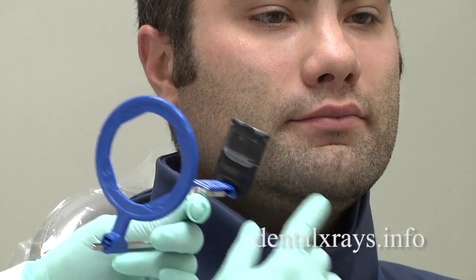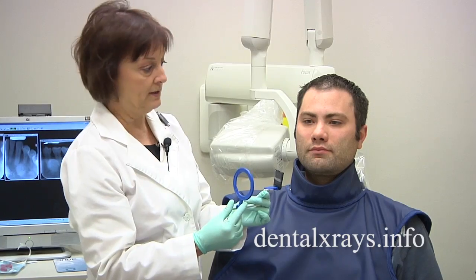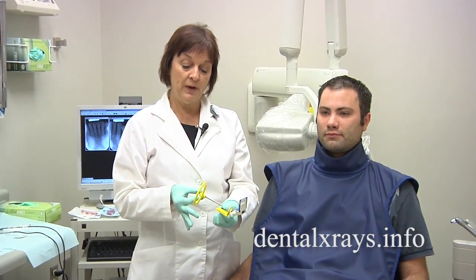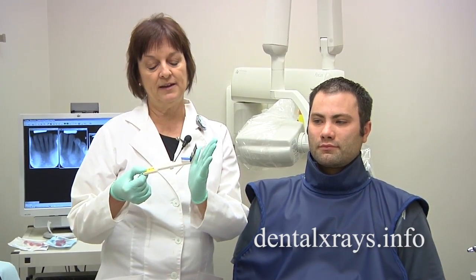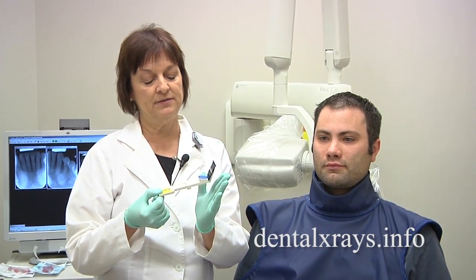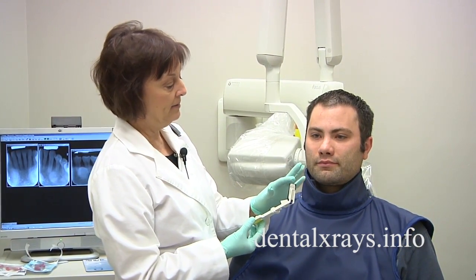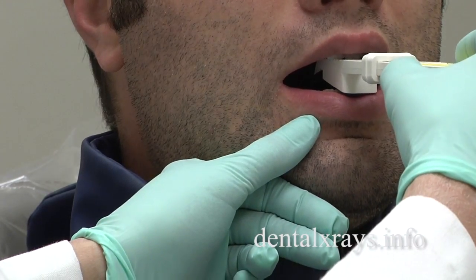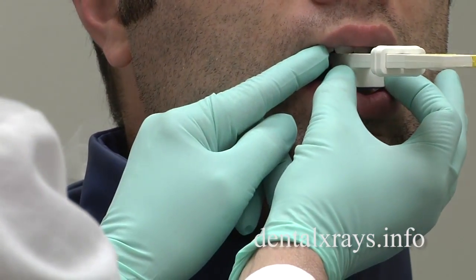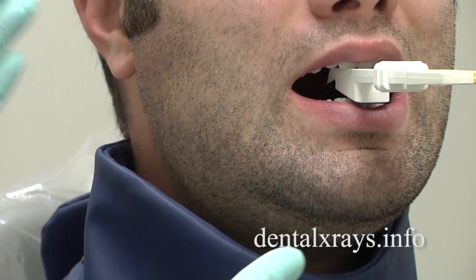Notice I did use a size one film — it is a little narrower, and depending on the shape of the dental arch, you can use either a size one or a size two. For offices that use bisecting angle instead of ring instruments, you can actually get some nice films with tori as well. I'm using this type with the slant of the bite block, which places the film more at a slant instead of straight. It doesn't matter which type you have — they both work really nicely. Again, the bottom edge is going to go behind those two bumps, so you're going to put it really far back and raise it up before the patient bites down. This bite block is thicker and takes the place of a cotton roll, so you can eliminate that step.